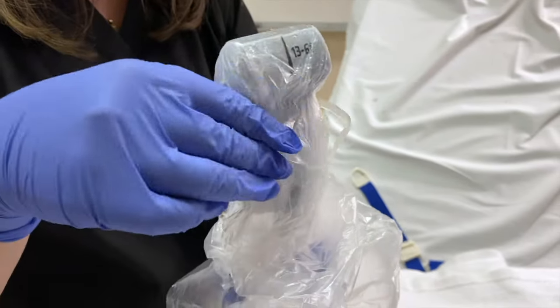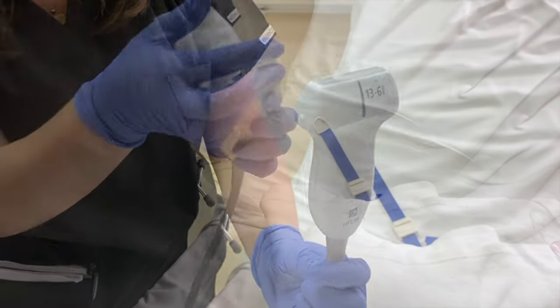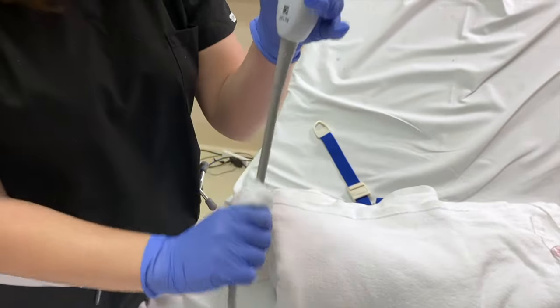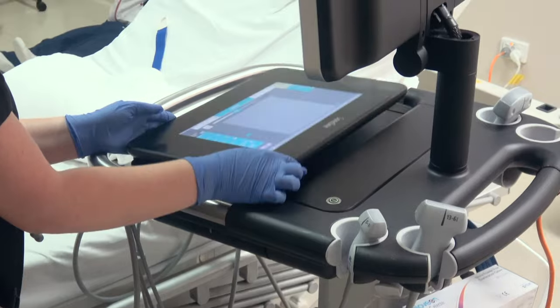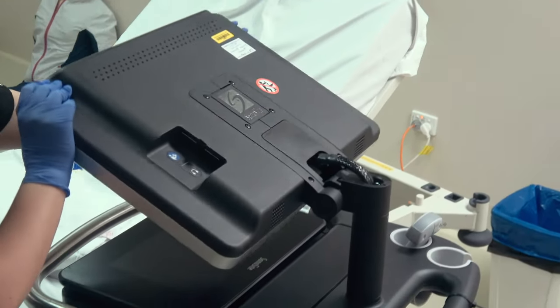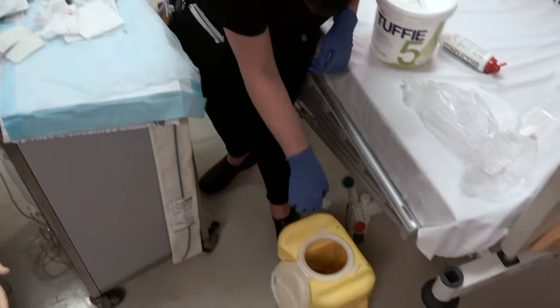Once the procedure is complete, please turn off the machine. Use Tuffie wipes to clean both the probe and the machine. Secure the probe safely and return the machine to its charging point. Please dispose of sharps and all clinical waste appropriately.